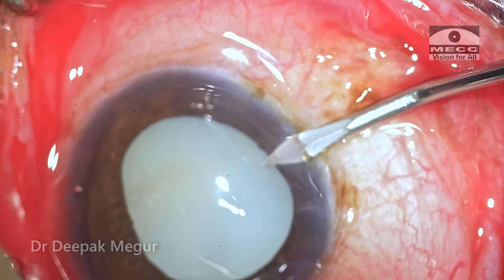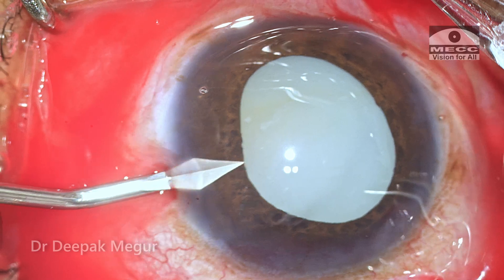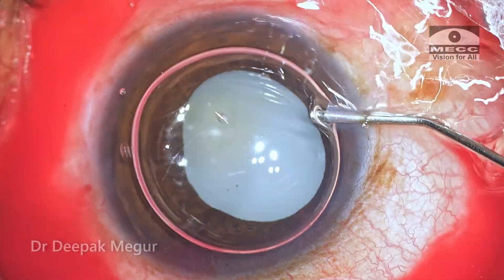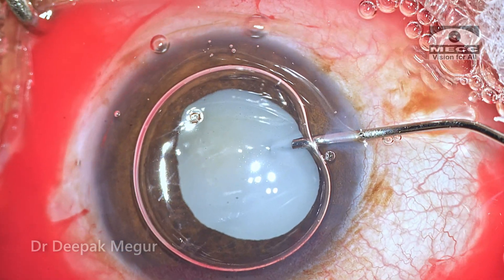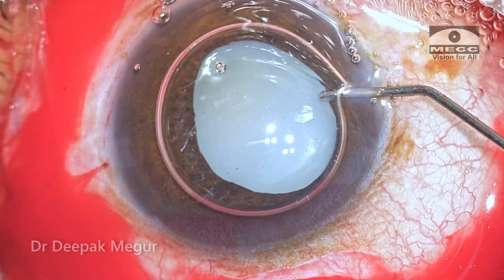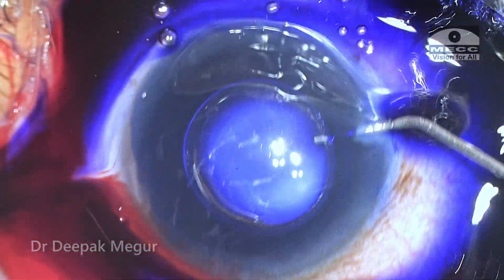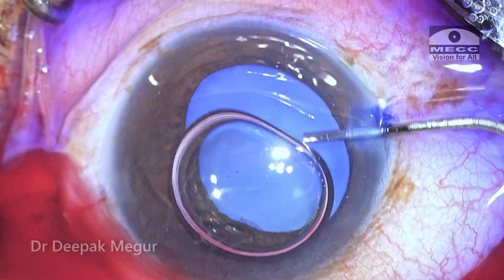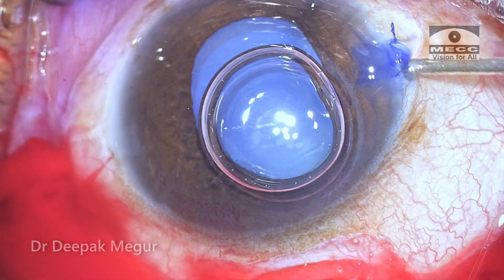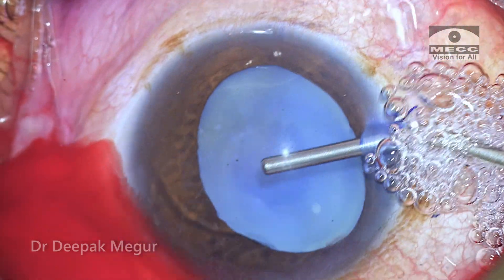The side ports are created and the anterior capsule is stained under an air bubble with trypan blue. The first indication of any zonular weakness will be appreciated only during the creation of the rhexis. If there is zonular weakness, we would see wrinkling of the anterior capsule and tearing the capsule would be difficult. That's the only moment where I can confirm the presence or absence of zonular weakness.